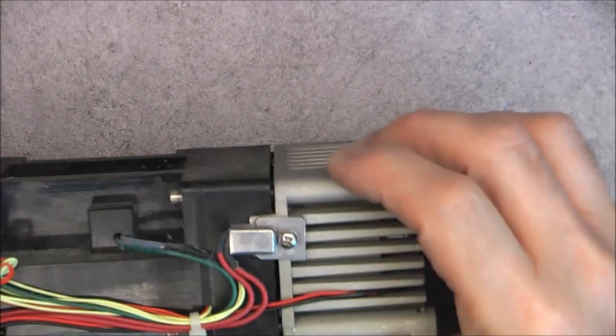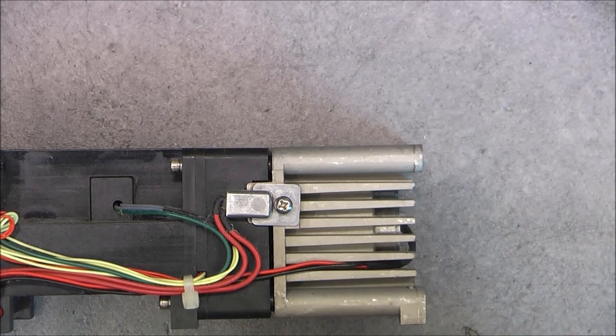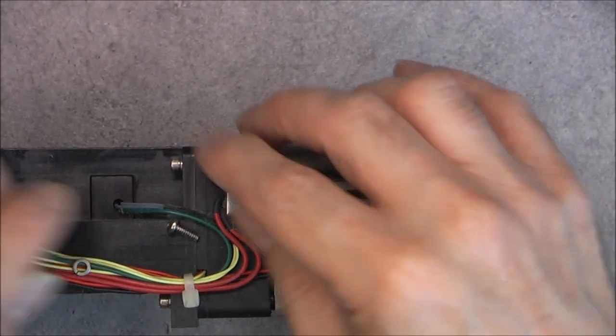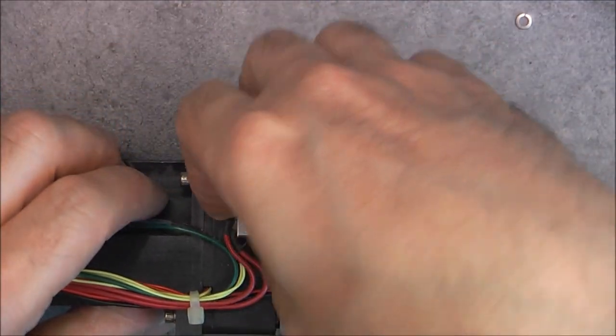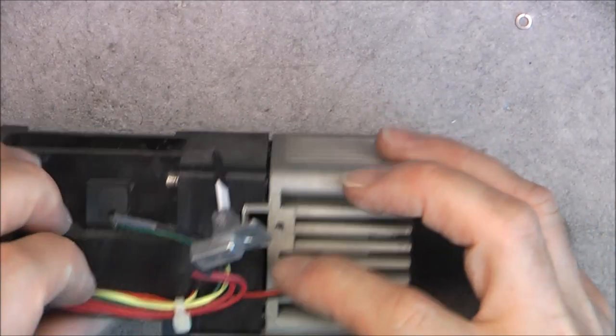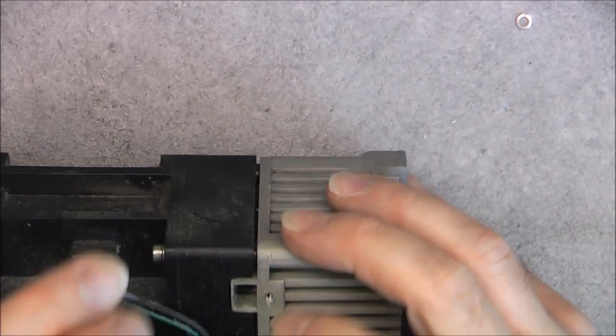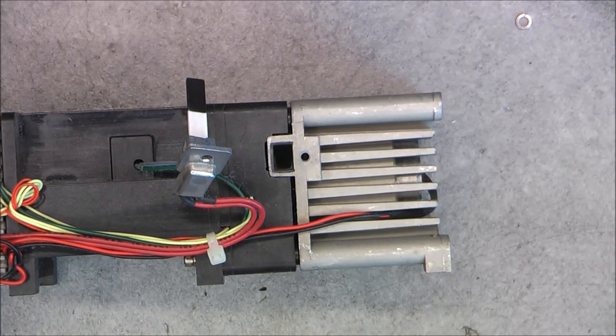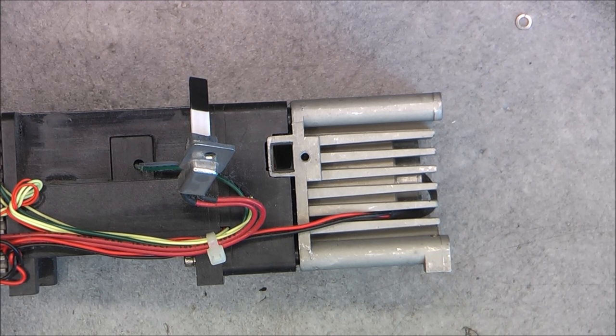But we will start by trying to have a look at this side here, probably some very special light source. I have one screw here for a temperature sensor. So most probably an incandescent light source. Interesting thing. I did not expect this. Maybe it is even a Peltier cooler. So let me find out, excuse me, if I have the correct Allen key for this.